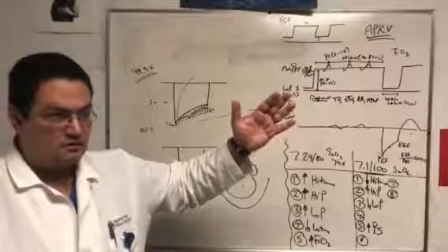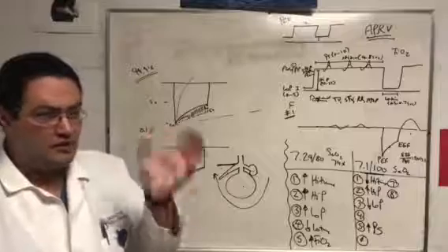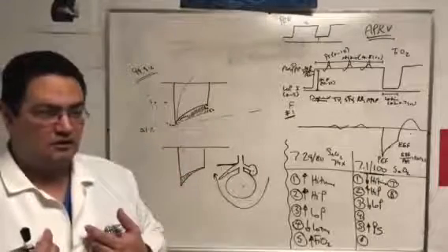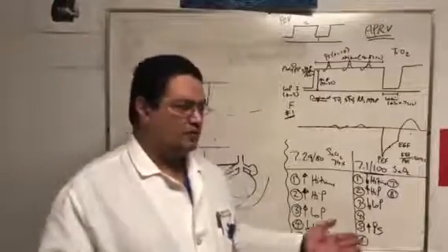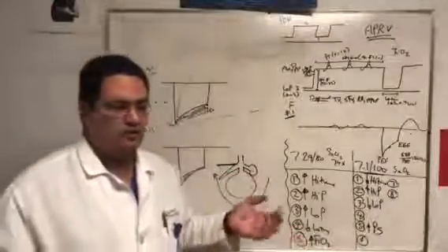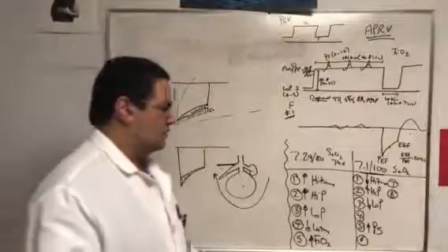And for 14 seconds, I'm giving the patient only 4 breaths per minute, and they're very tiny breaths. The patient might feel that they are short of breath, just subjectively. So we can add pressure support to them. And that's not going to negate any benefit, because the patient is improving anyway, right? So, you know, we can use that.